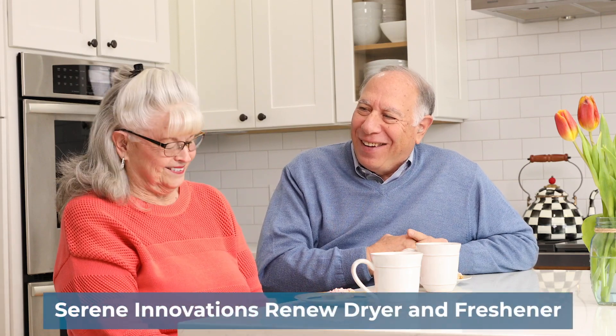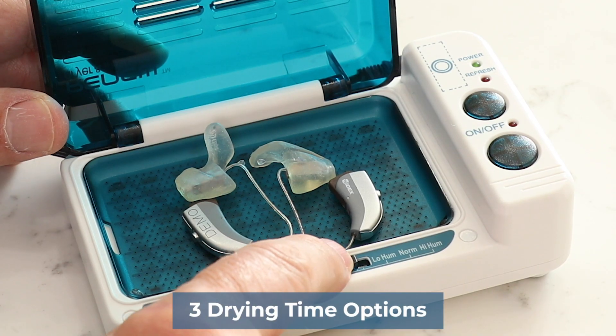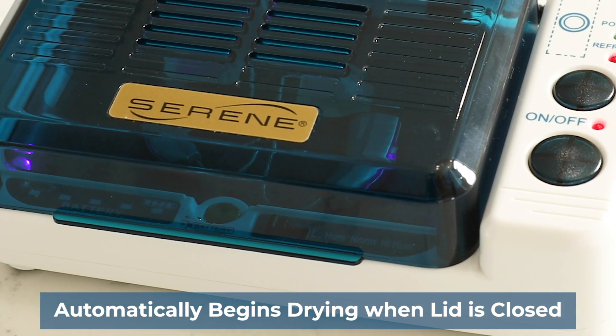Keep your hearing aids clean and preserve their life with the Serene Innovations Renew Dryer and Freshener. Select between the different drying times based on the humidity of your environment, and the sensor will automatically begin drying once the lid is closed.